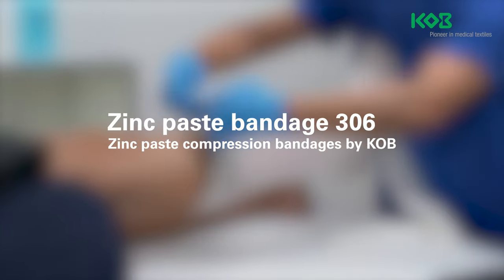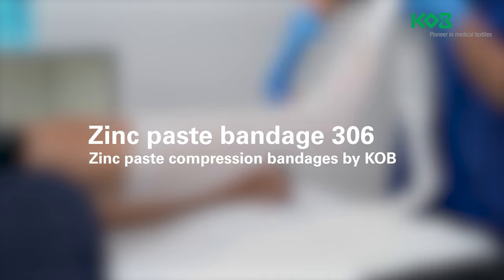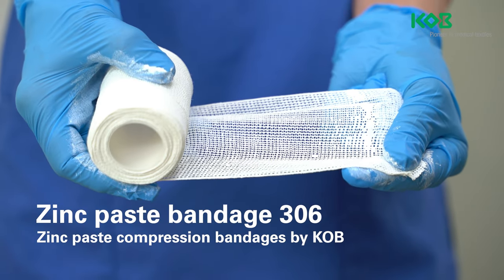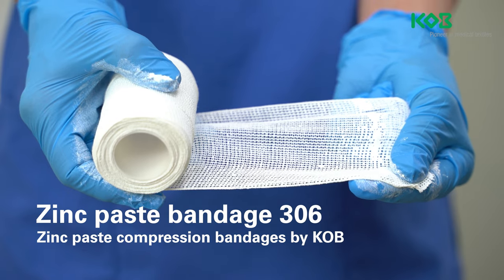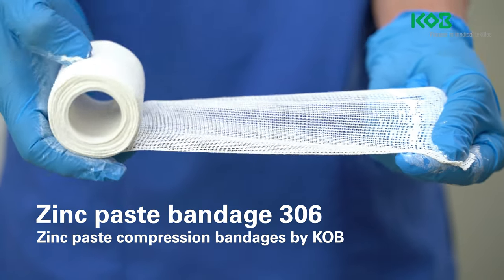Zinc paste bandages by KOB are single-use products used in compression therapy for venous diseases and for the treatment of oedema caused by other factors such as lymphoedema, post-traumatic oedema, cyclical idiopathic oedema, and lipoedema.